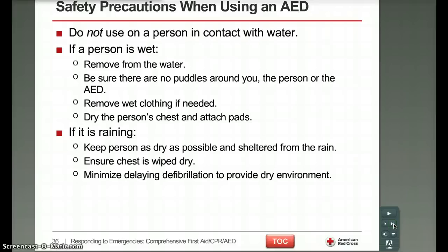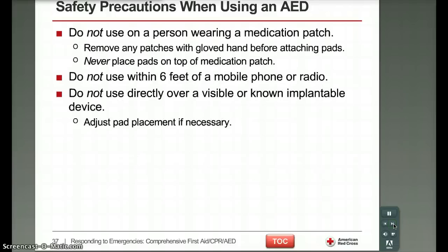If it is raining, keep the person as dry as possible, shelter them, use an umbrella, possibly move the victim if we need to. Ensure the chest is wiped dry, and we want to minimize delaying defibrillation to provide a dry environment. Once again, contact with water is something we really need to avoid, and we need to get that chest as dry and as quickly as we can.